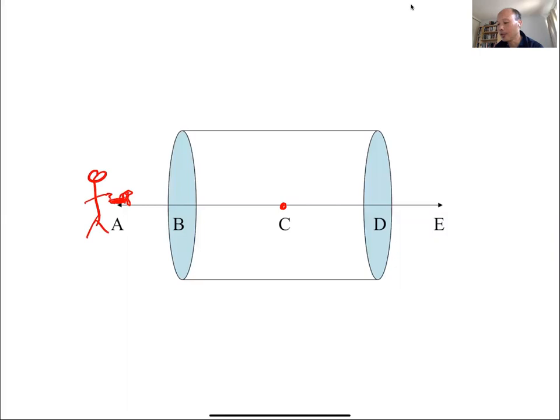To answer the question, how much force would be applied by a 30 Gauss field to a metal object like the wrench? It's actually not the field that matters, it's the change in the field. So it's the dB/dz, the change in field. And so it depends on how quickly those fields are changing. It depends on each magnet, but as you saw from the video, close to that magnet there was 50 pounds of force. It's typically on the order of 50 to 100 pounds of force. And it's very misleading because you can be 3 feet away from the magnet and not feel much. You can take one step forward and all of a sudden the force changes rapidly and things will be pulled out before you even know it, okay?